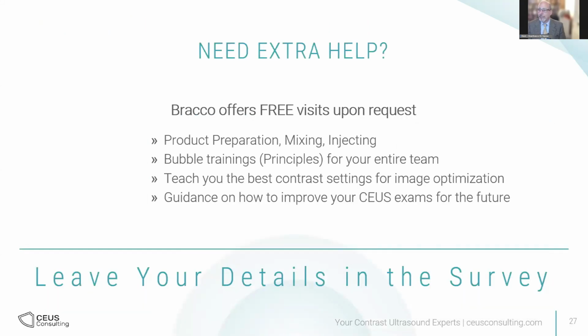If you need extra help, Bracco offers free visits upon request. The format is you will have an application specialist like me with you all day while you scan your contrast patients. We will assist you on everything related to the contrast examination, from preparation, mixing, injecting, bubble trainings, principles for the entire team.